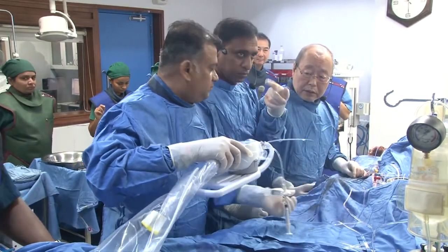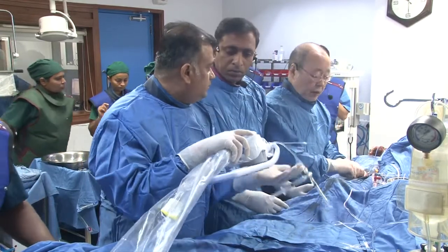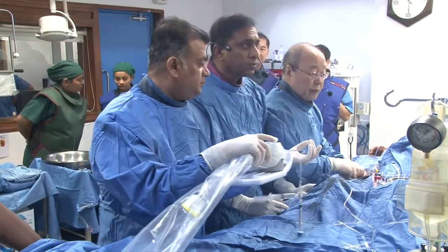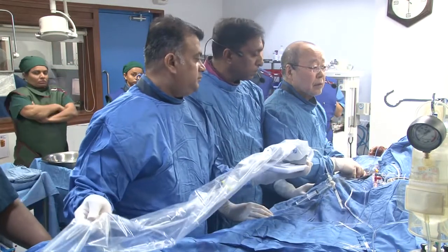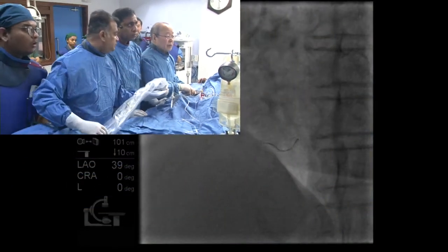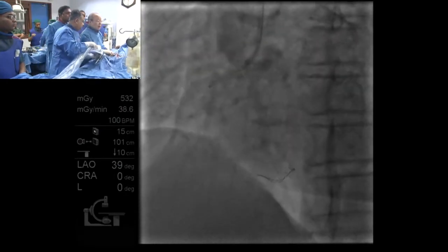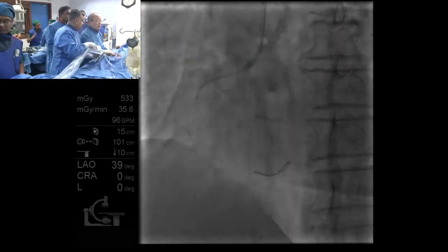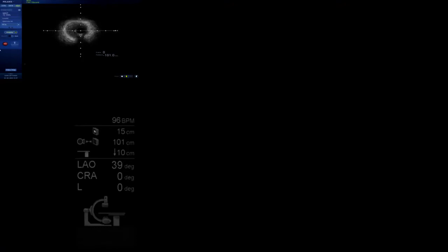Absolutely. If you can't dilate, then even if there is a little bit of a tear, we still rotablate. I think if the IVUS shows that you're right next to the external elastic lamina with passage, that would concern me somewhat, not just about atherectomy, but about stent sizing and post-dilation. That's an advantage of having some intravascular imaging in this situation.